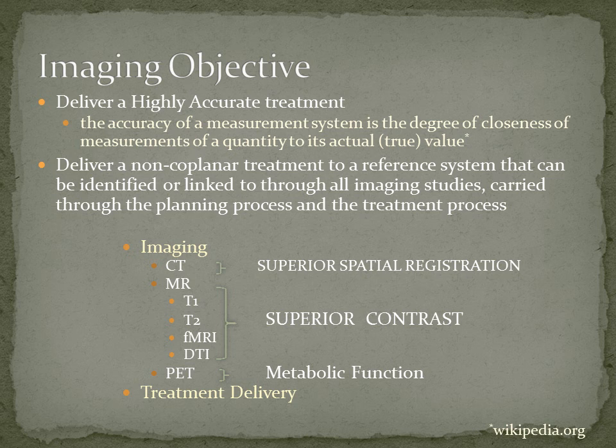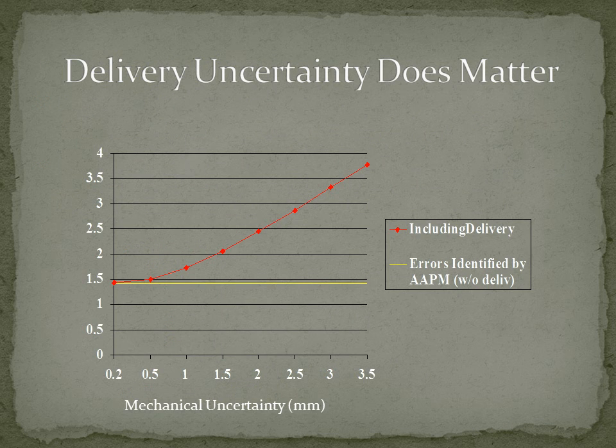We then rely on our MR sequences, and any other sequences, for our tissue contrast resolution. And then by using image fusion, we combine these two and get the overall accuracy that we need for the system. People often ask, if your voxel size on the CT scan is a millimeter by millimeter by millimeter, why do you need to have sub-millimeter precision in the entire process?